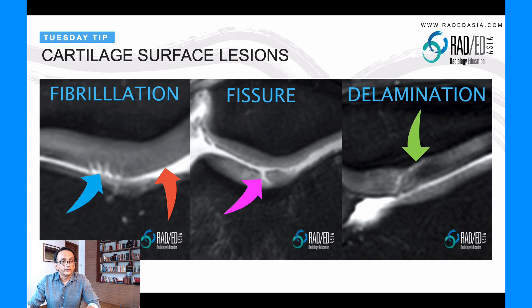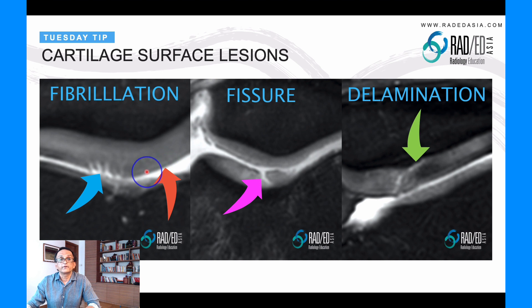We're looking at cartilage today, and in particular, we're going to look at the surface lesions of cartilage. It's actually pretty straightforward — we have a number of types of surface lesions. Let's look at normal first. The normal cartilage surface is well-defined, has a sharp margin, and it can have this low signal at the surface, which we've gone into previously. So what we're looking for in normal is a nice, sharp, well-defined surface.